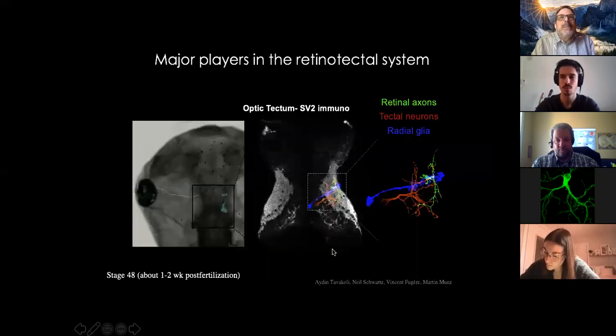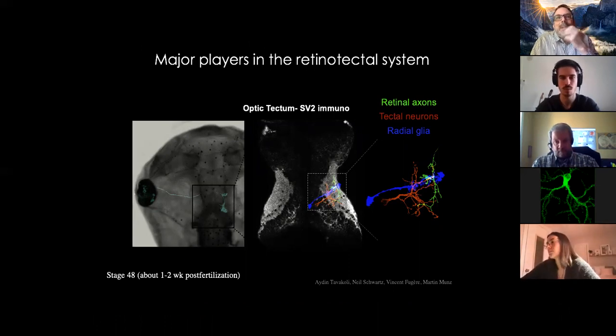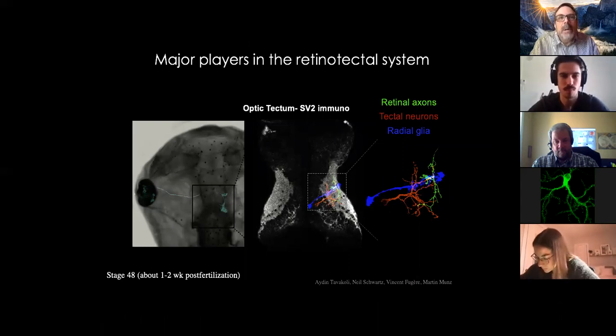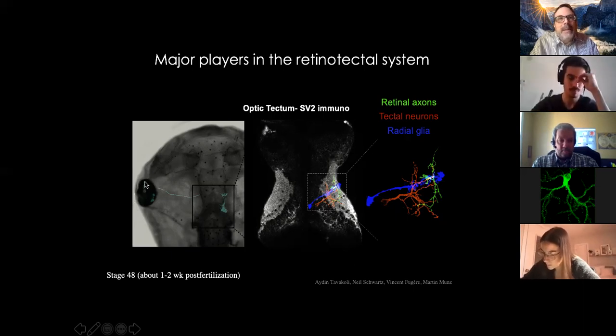So what I'm going to show you is a little bit of the work that we've been doing to try and identify single cell structure in the retinotectal system and then look at functional imaging. So this is basically the retinotectal projection of Xenopus, the system that we're largely focusing on. We use as our main method for expressing green fluorescent protein electroporation, and I'll show you why it's so convenient shortly. This is a stage 48 tadpole, which, as I said, is that stage when there's an enormous amount of remodeling going on in the optic tectum. And we can just inject plasmid into the eye, electroporate, and this is what you get.